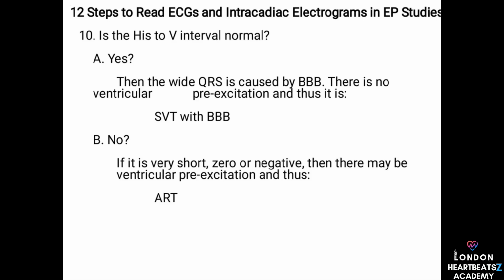Yeah. But what if there's no His tracing for every QRS complex? That's a sign that the signal is taking a detour off the beaten path, like the traveler decided to go off-roading. This is a hallmark of VT without retrograde conduction. The ventricles are just making their own impulses, completely ignoring the atria. So, no His tracing means the ventricles are going rogue.